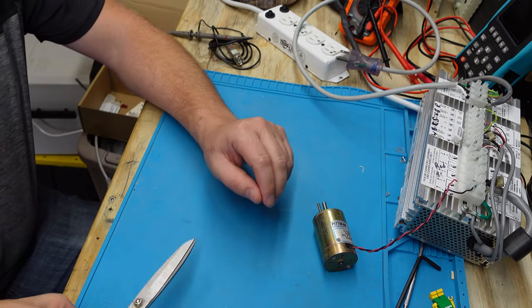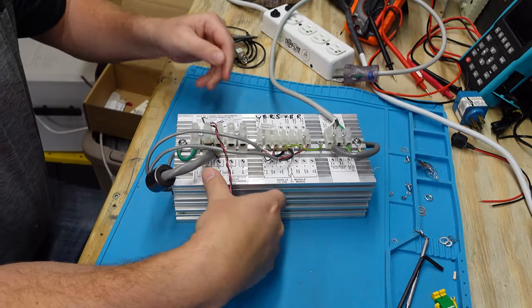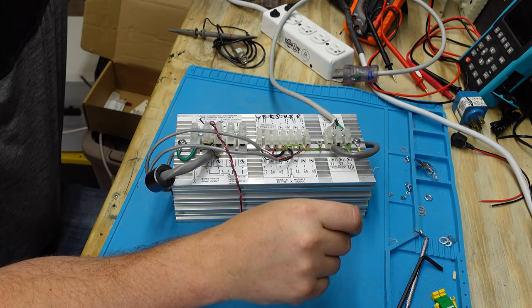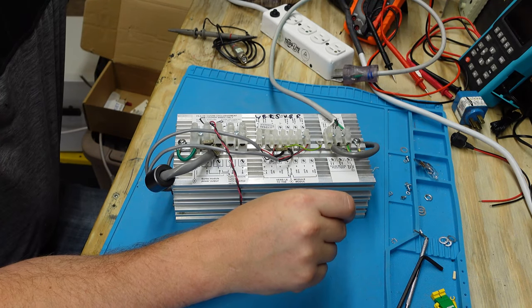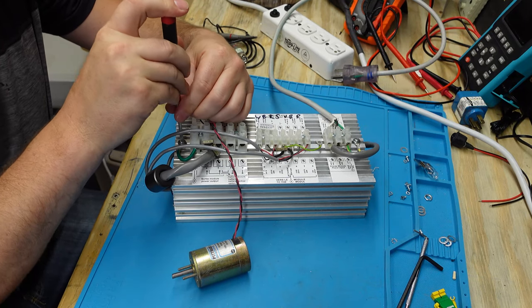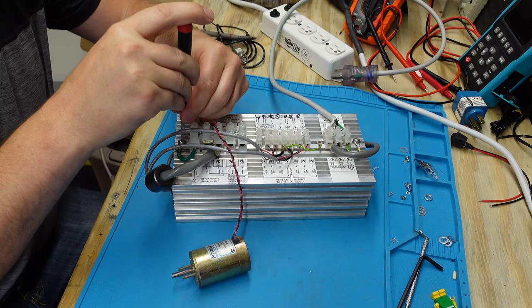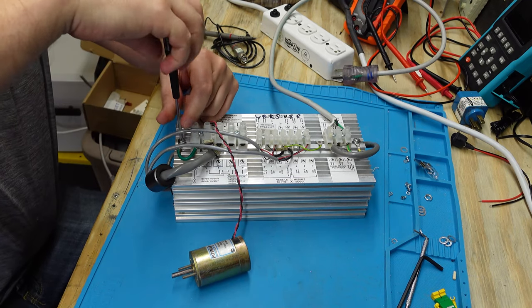Hey guys, welcome back. Today I'm going to open this guy up. We're going to do some exploratory surgery and see what exactly is going on inside this guy. Can't guarantee I'll figure it out. Probably won't, in fact. And it doesn't really matter because I've already replaced the component. So who cares?